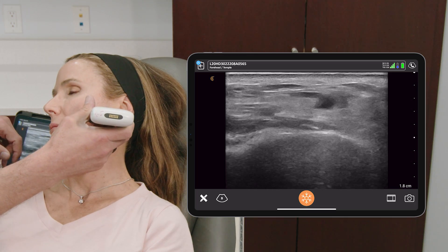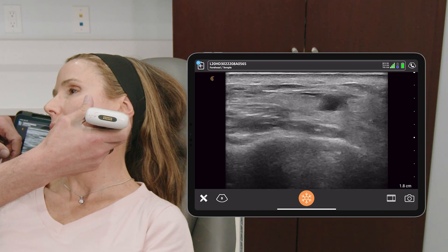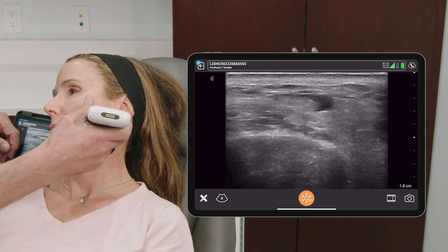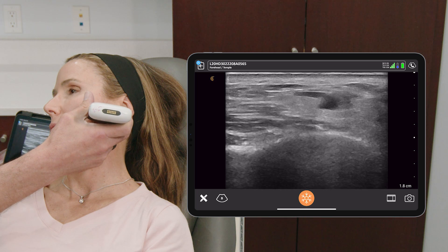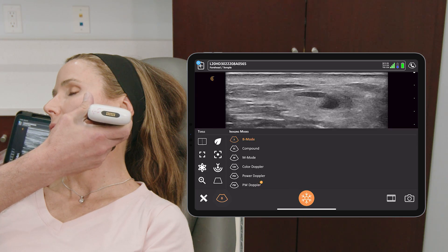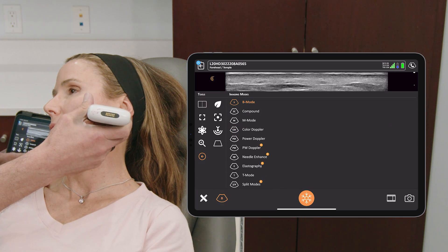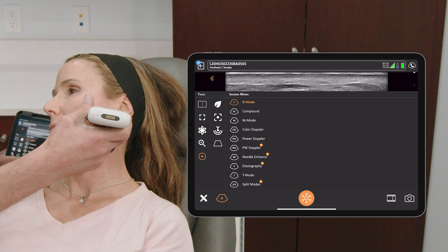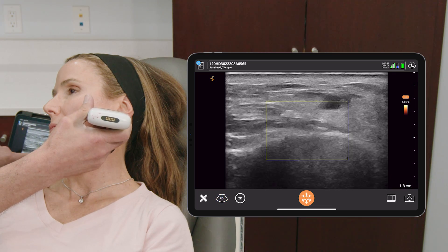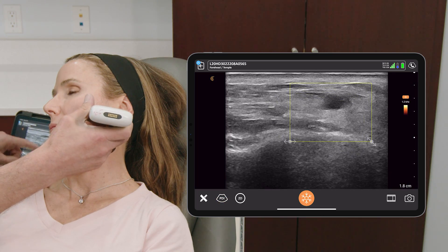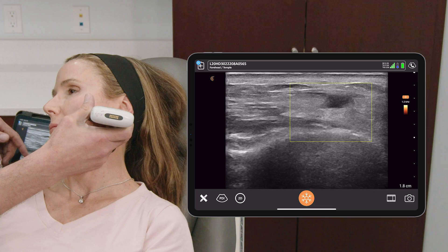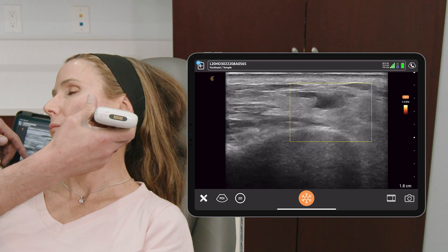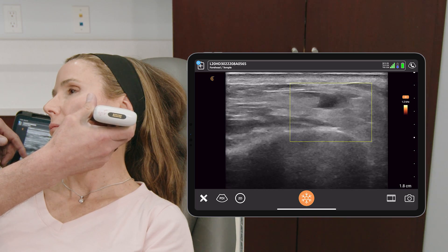Lymph nodes are going to have a hilum to them and they're going to have a little bit of vascularity to them. So let's turn on the vascular — let's go with Power Doppler — and let's look to see if there are any vascular structures in this area. We don't really see that.